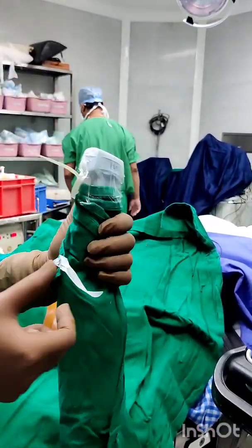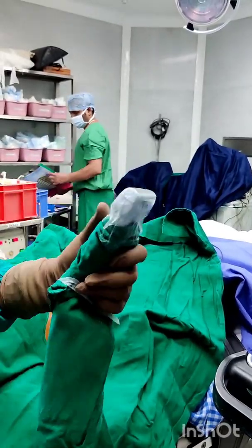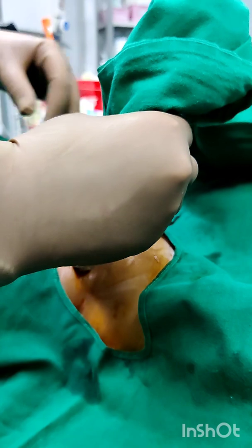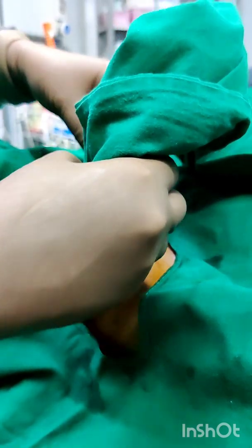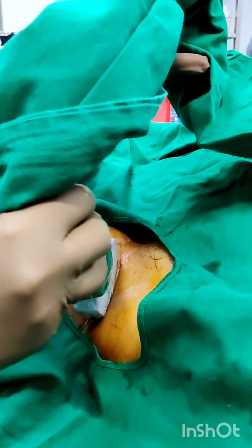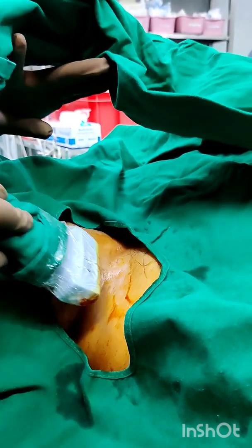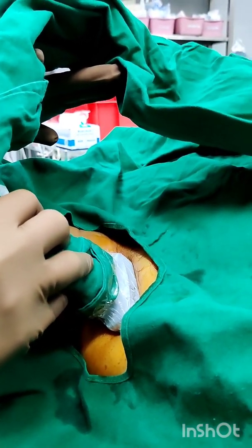For the beginners, the ultrasound probe can be first placed in the neck at the level of cricoid. Locate the carotid artery, move slightly laterally and then downwards and then gradually tilt the probe caudally, aiming at the ipsilateral thoracic cavity. In the ultrasound image, you can see the carotid artery.